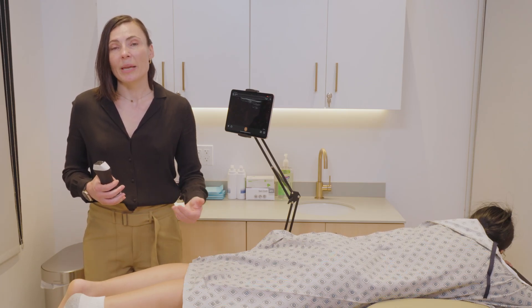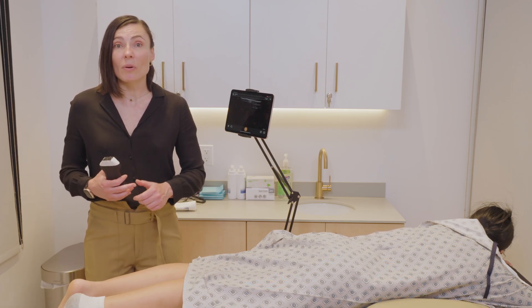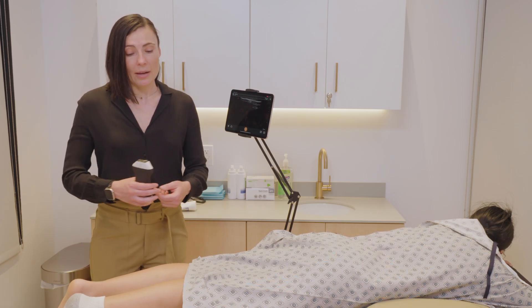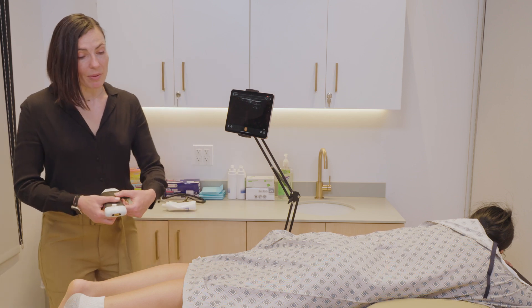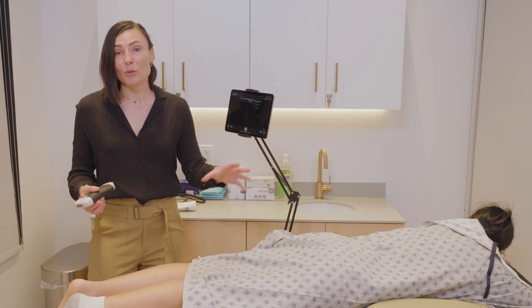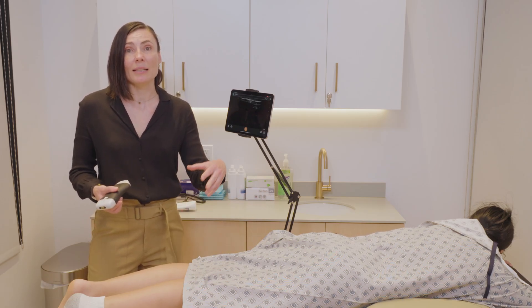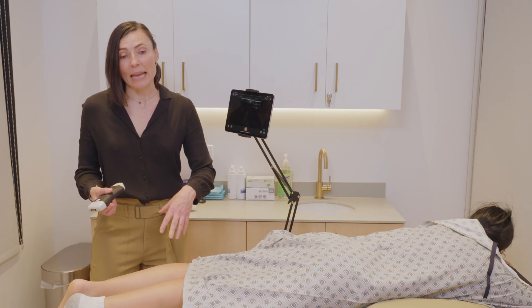Let's go over the indications for this — that would be patients with posterior ankle pain that you're concerned for Achilles tendinopathy or an Achilles tear. I typically have the patient in a prone position, like we have here, but you can also do it with the patient sitting down and feet hanging down.